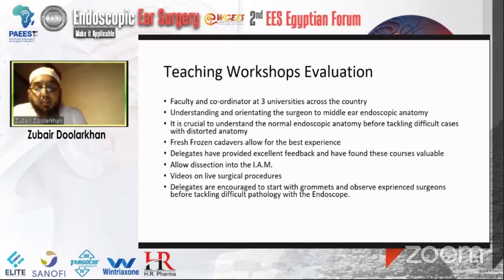The experience has shown that the fresh frozen cadavers allow for the best experience, and delegates have provided excellent feedback and have found these courses very valuable. In these courses, we allow dissection into the internal auditory meatus to the cerebellopontine angle, like was described by Professor Mohammed. And if we have time, we show the participants some live videos, and then we encourage the delegates to start with small procedures first, and to go and observe experienced surgeons before tackling difficult pathology with the endoscope.